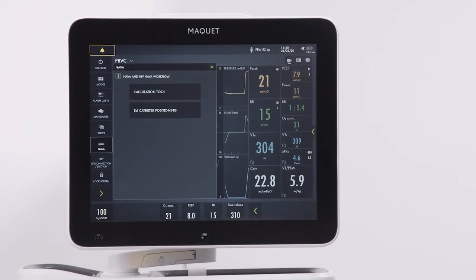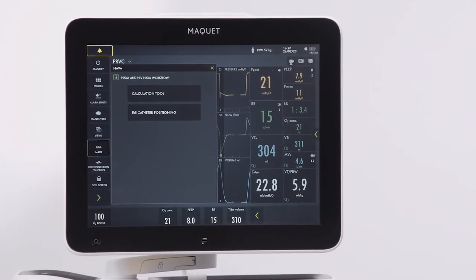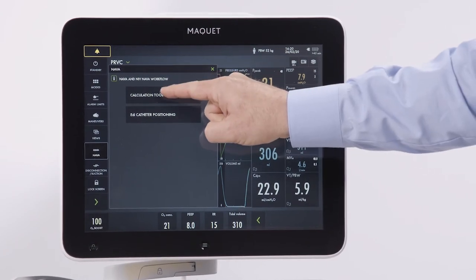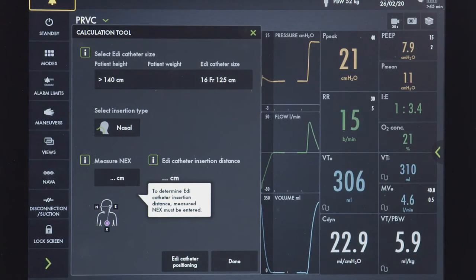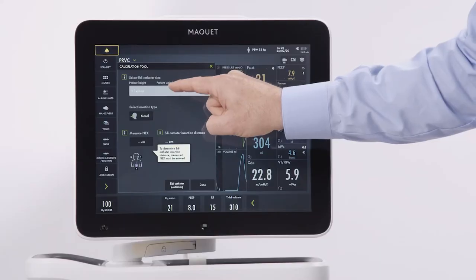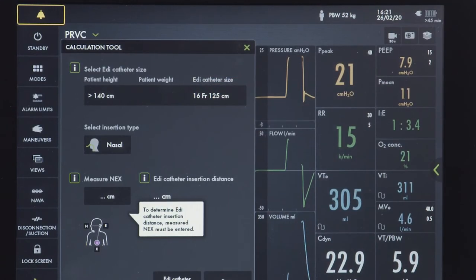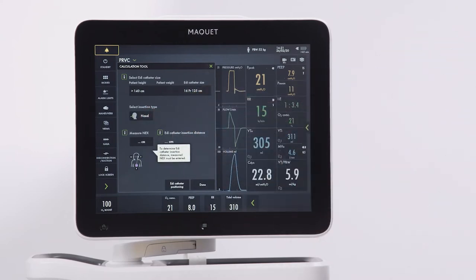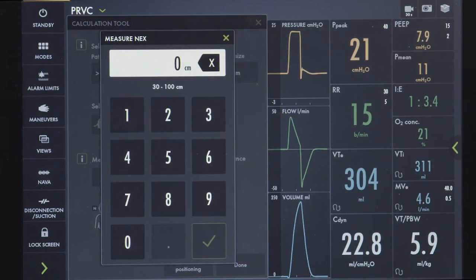Now go to the calculation tool. If you are using the EDI catheter measuring tape, you won't need to use the calculation tool. However, if you have used a standard measuring tape, you enter the size of the EDI catheter, oral or nasal insertion, and enter the NEX measurement. Then you will get the insertion distance.